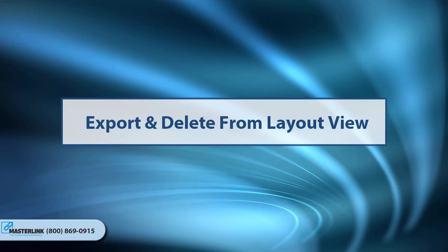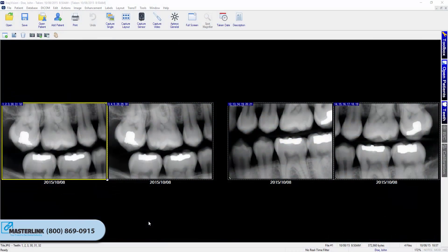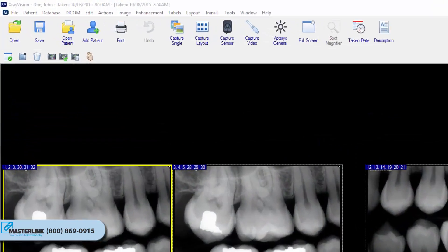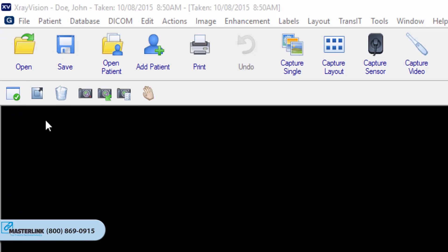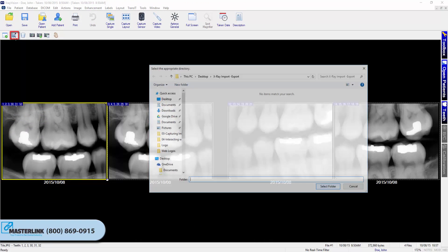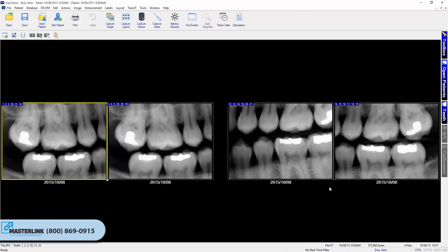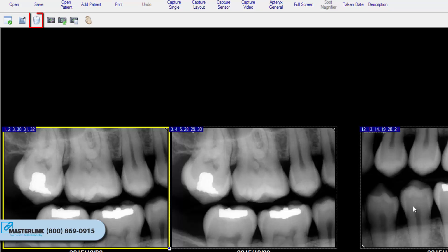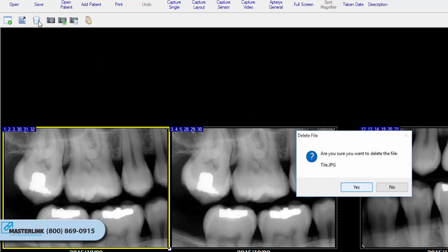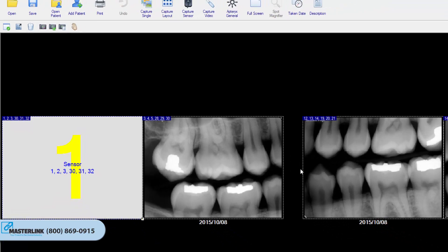Exporting and Deleting from Layout View. Users can export or delete images from within the layout viewing window by using the appropriate buttons. The export button sends the selected image out of the software to a user-defined directory. The delete button permanently deletes an image file from within the layout. Note: once an image is deleted, it cannot be recovered.